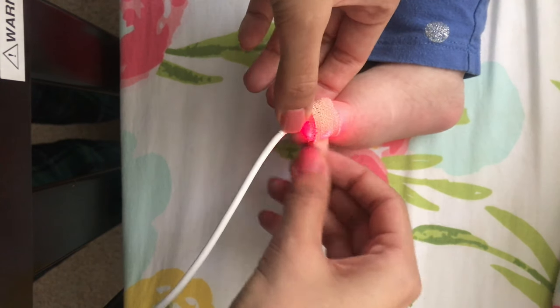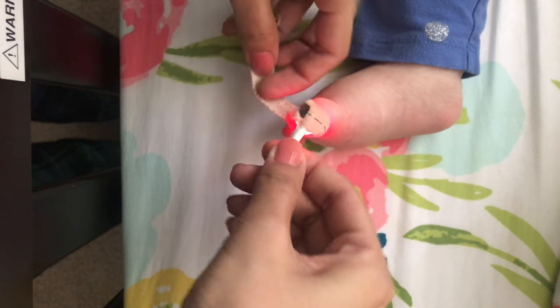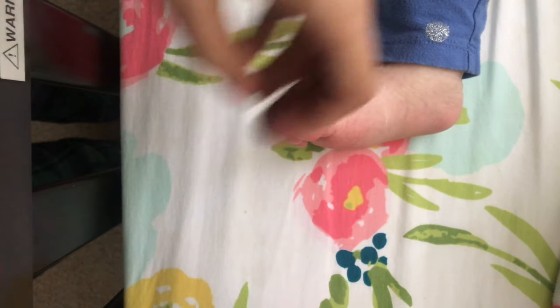Every morning I take the oxygen probe off of Hania's toe. The drawback of oximeters is that if your child moves a lot during sleep, the probe may loosen and fall off and give an inaccurate reading.